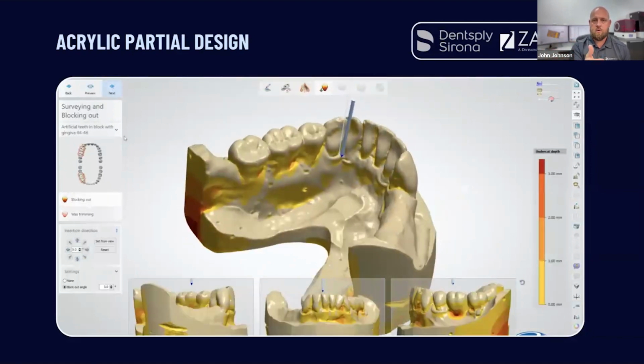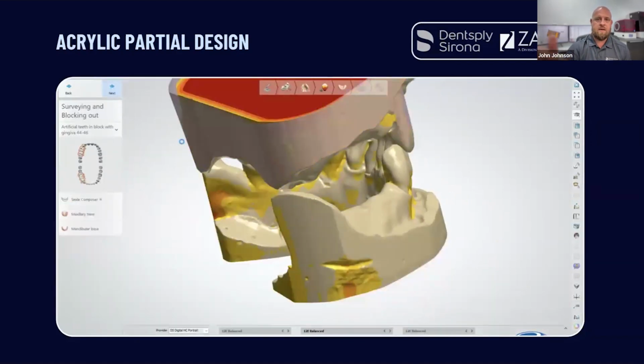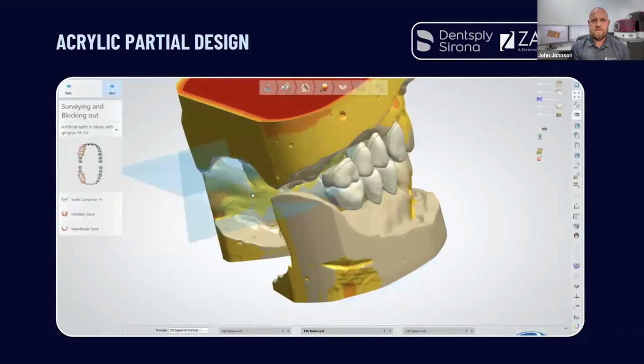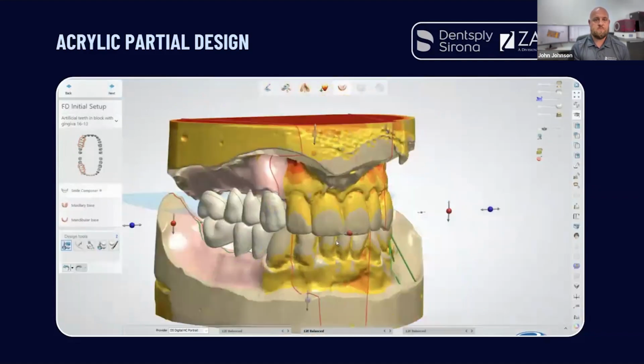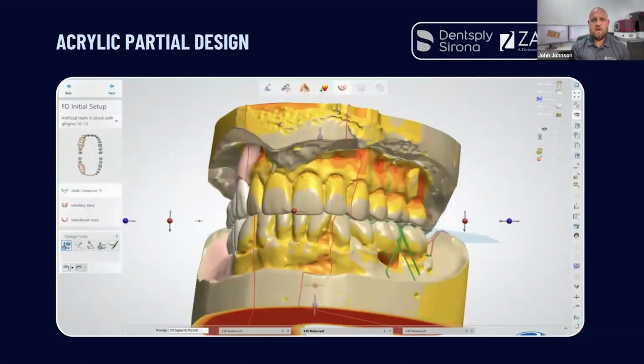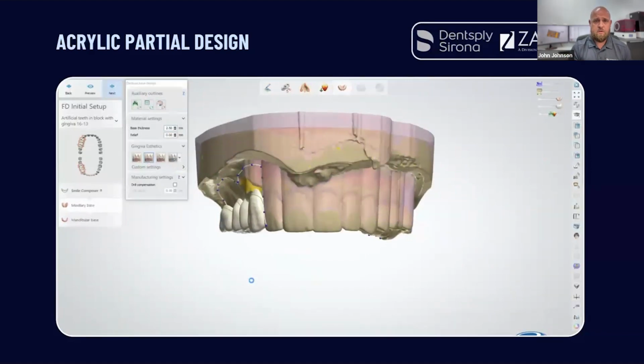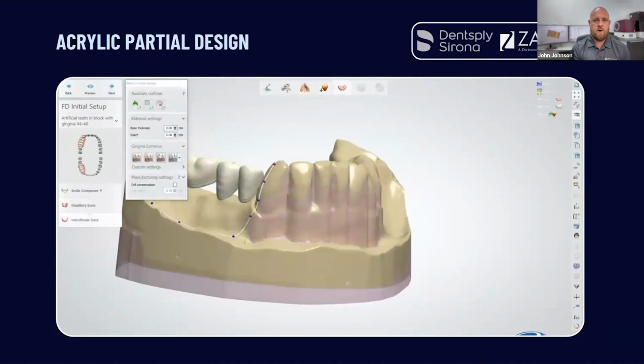Again, this is another really cool feature: all that yellow that you see on the inside of those teeth is an undercut depth. So you can really get pretty precise with how much undercut you are exposing or how much you want to block out. That's a really cool feature to be able to control. And that's kind of just upper lower setup. Now with this, you could either generate an acrylic clasp if you wanted to, or you could later on cut and bury and light cure a wrought wire clasp in there. And like I said, it's all case dependent, and you pick which one fits you the best and go from there.